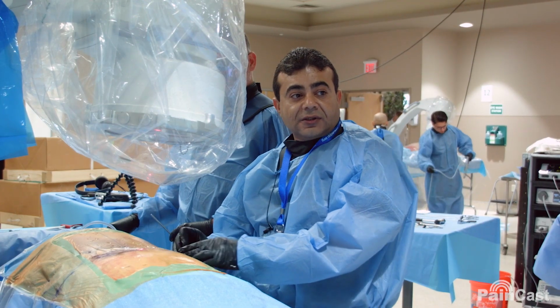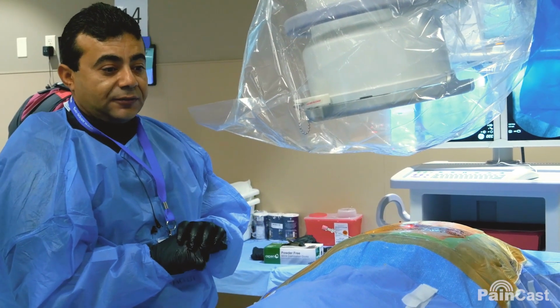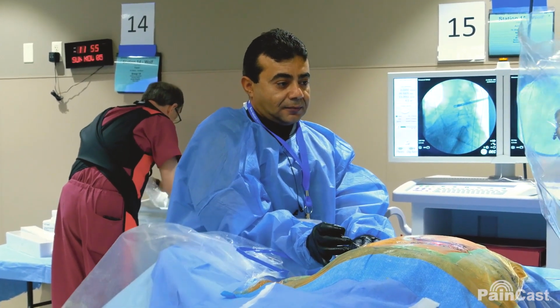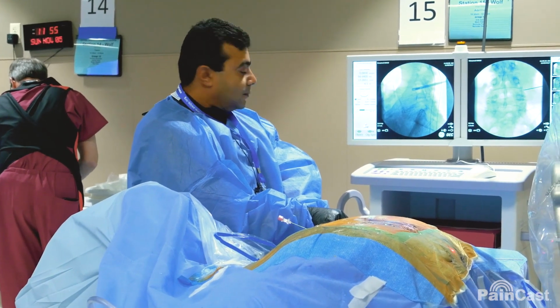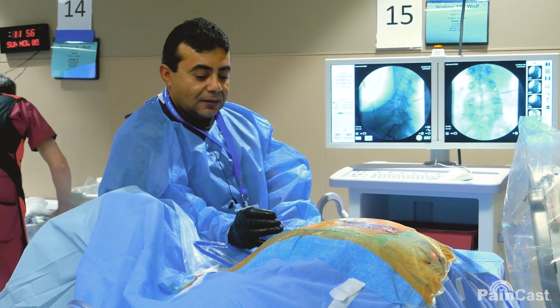Okay, so here, X-ray. So now I felt I'm going through hitting the facets. I asked for lateral view to confirm that I am hitting the facet joint. Okay, so I see I'm hitting the facet joint. Take it out. Just change my angle. X-ray.